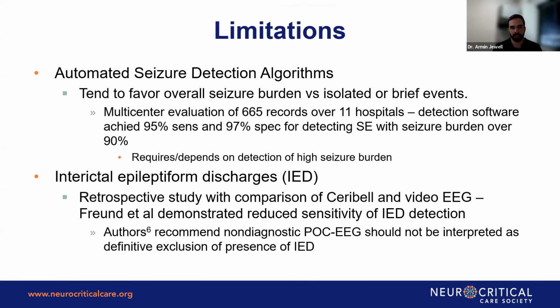Other limitations include the detection algorithms. AI, of course, has its place, and it does have utility as a tool to combine with physician interpretation. The detection algorithms tend to favor seizure burden instead of isolated or brief events. Essentially what it looks at is the frequency of seizures. So it is less sensitive for detecting things like interictal discharges or very infrequent seizures, and there is higher sensitivity and specificity with conventional EEG.